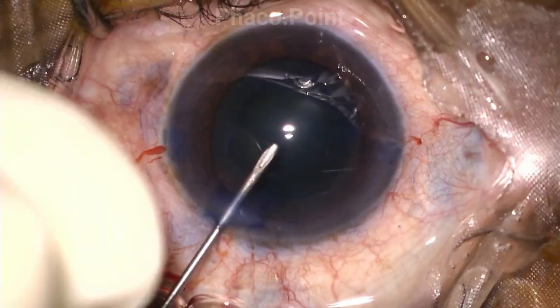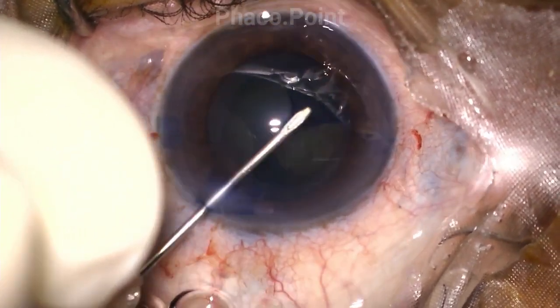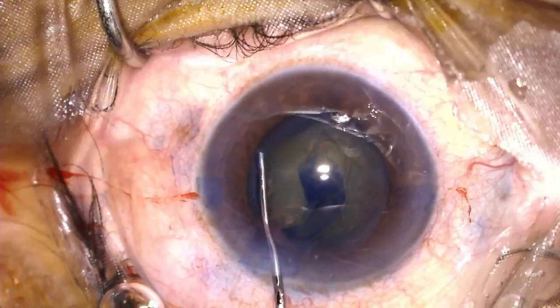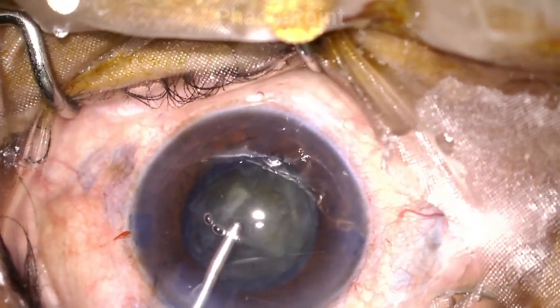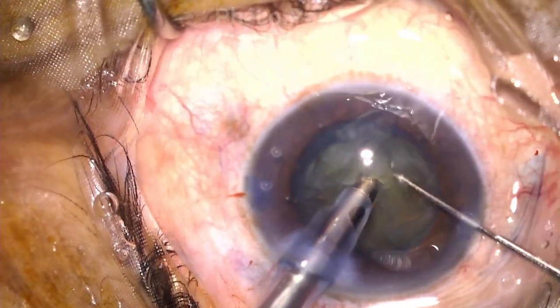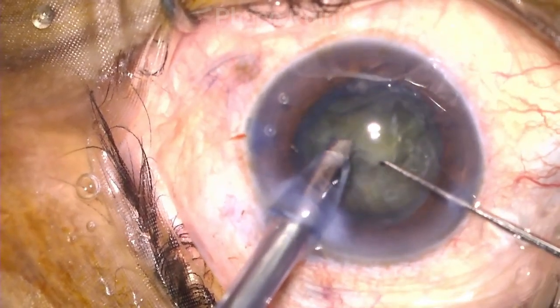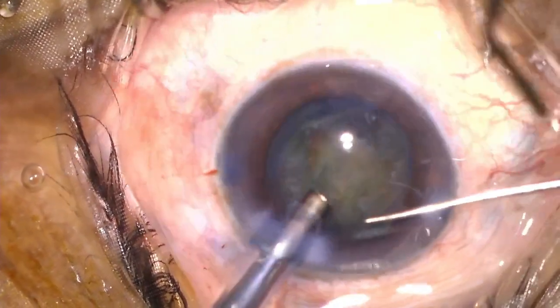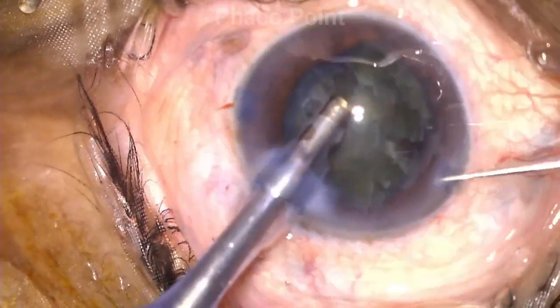We proceed with the surgery by performing the capsulorhexis, hydrodissection, and then nucleus management. During nuclear emulsification, the surgeon uses a chopper to emulsify the nucleus. Please note the appearance of the side port incision — instruments go in and out without any struggle, and this incision size is so precise that it doesn't allow excessive egress of fluid, which could cause surge and shallowing. The surgeon performs the direct chop technique, breaks down the nucleus into smaller fragments, and completes nuclear emulsification.